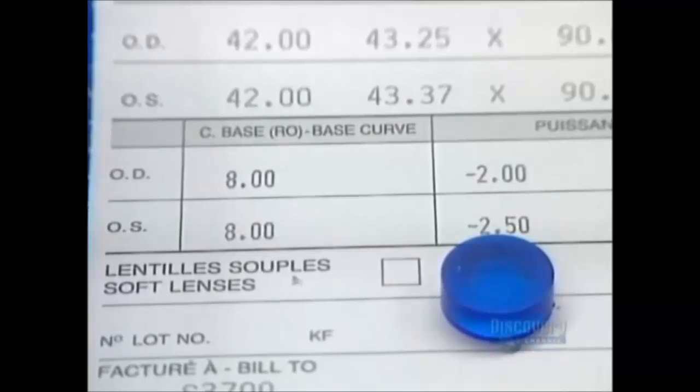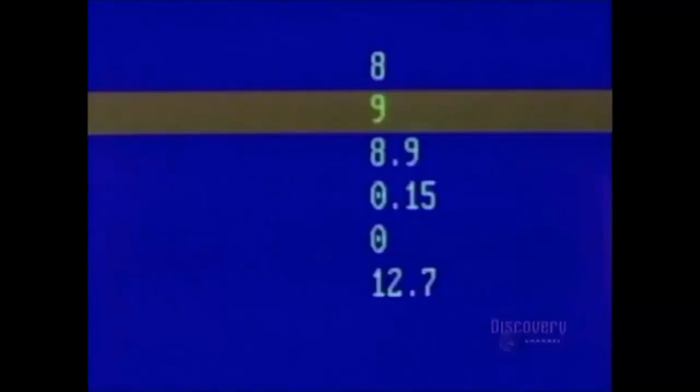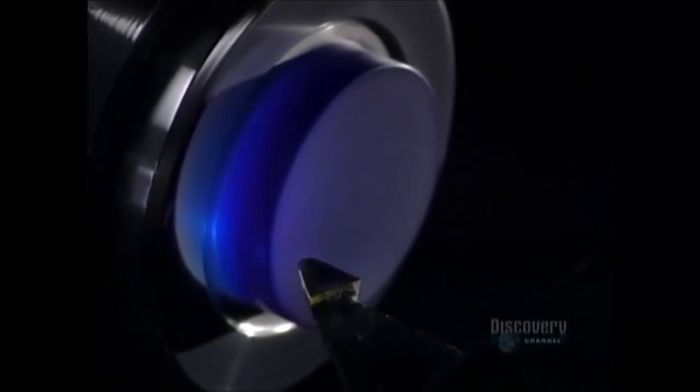We see here a patient's prescription, essential to the fabrication of lenses. The process begins with data processing — control of the shaping data is supplied by a computer which controls a digital lathe. They begin by shaping the inner curvature of the lens.